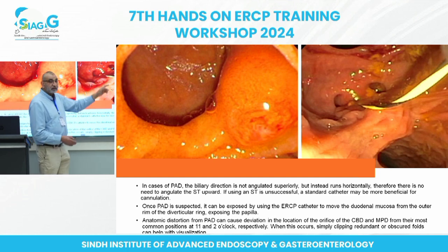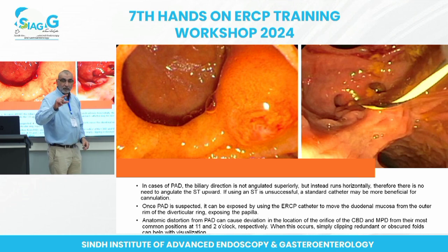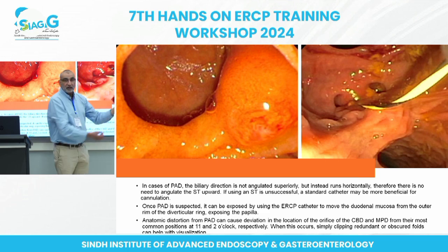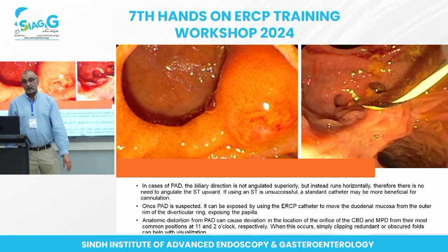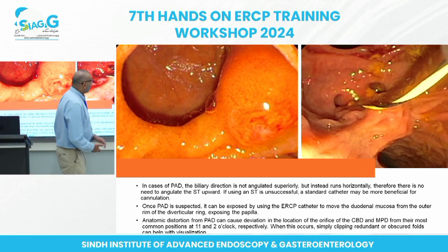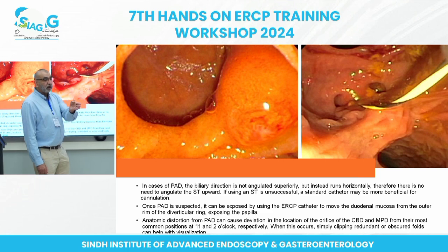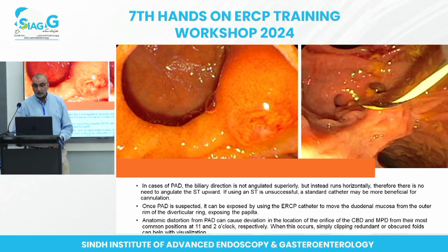The other option, which I prefer to use, is that you can use a hemoclip, especially the bigger one, and deploy it somewhere around here, and जब उसको close करते हैं, it pulls the papillary orifice out towards you, so then you can cannulate that, and that usually works. Sometimes you may. एंगल पे लगाना है उसको जो. हाँ, मतलब वो तो आप उस वक्त assess करते हो ना कि कहाँ बेस्ट है. तो उसमें हो सकता है बहुत वक्त आपको एक की बजाय दो लगाने पड़े, लेकिन उससे ये होता है कि it brings the papillary orifice into a more approachable position.